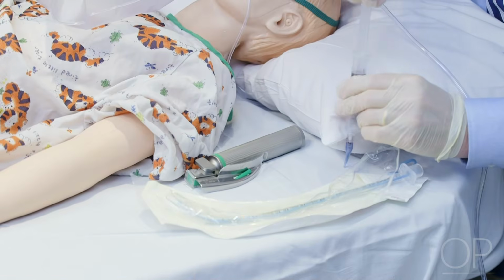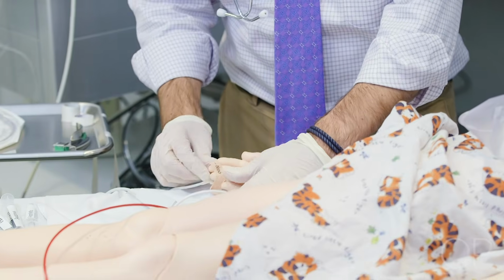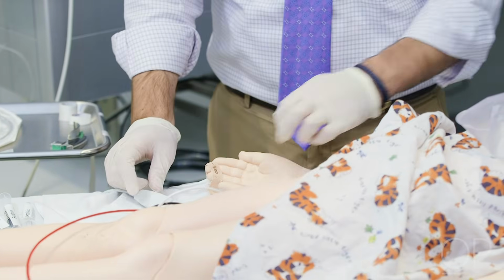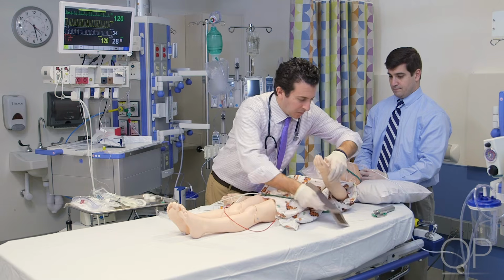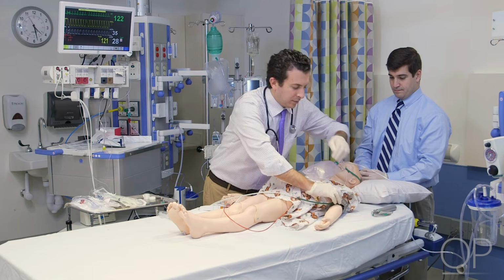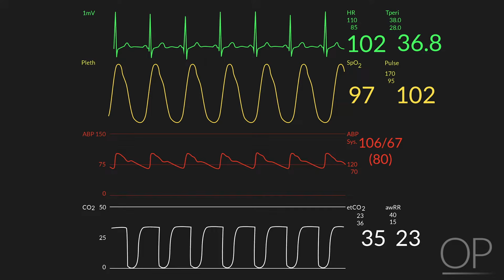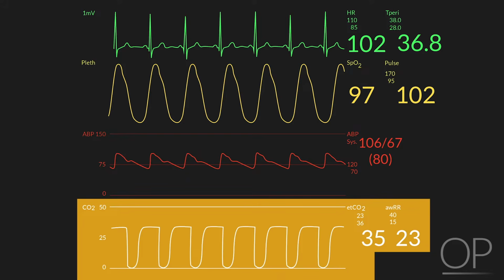working order. The team should ensure that the patient has monitoring leads and a pulse oximeter in place. The blood pressure cuff should be placed on a different extremity than the pulse oximeter and set to cycle frequently. Check that the IV is patent and functioning. Waveform capnography can be used to monitor adequate bag mask ventilation and confirmation of tracheal intubation.